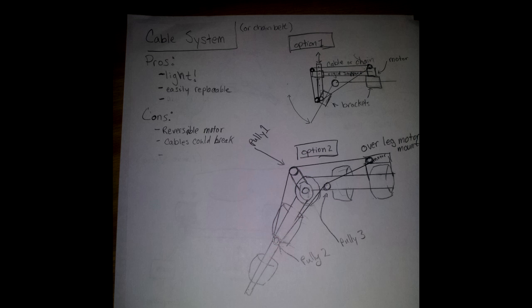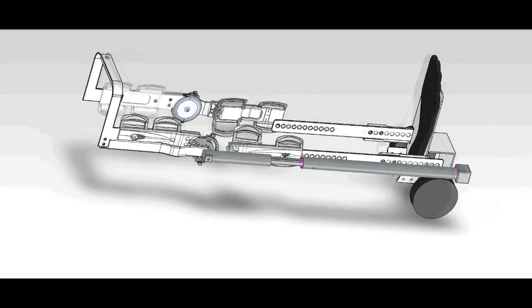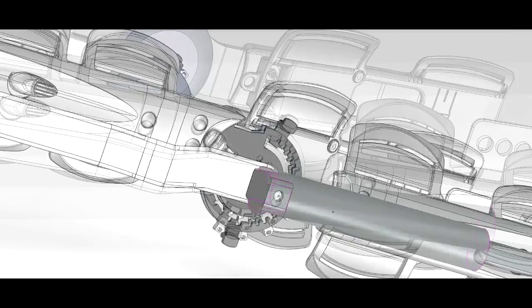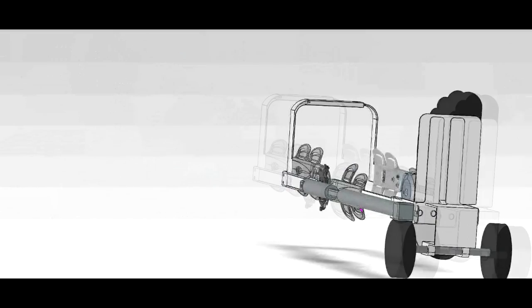Because of their powerful nature, hydraulics were also examined as the necessary torque requirements for varying leg sizes was a rather large and daunting variable. Finally, a drive shaft and foot brace system was proposed in which the motor would power a low-speed drive shaft running up the length of the lower leg to the knee and drive motion at the knee joint.